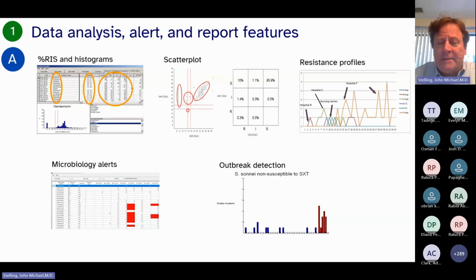But that takes time and energy and equipment and funds and the knowledge. We cannot do molecular typing in everything, but we can look at the phenotype. So by looking at the phenotype, I can see there seems to be something interesting and important happening here. There seems to be a growing subclone of E. coli that is growing. If I am very concerned, then yes, I can also do molecular typing.